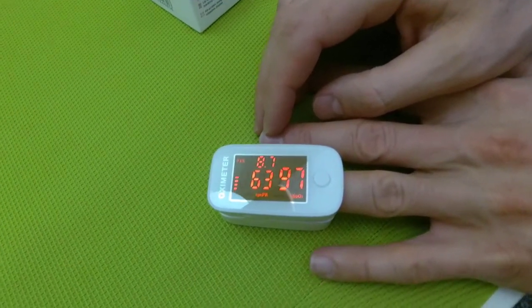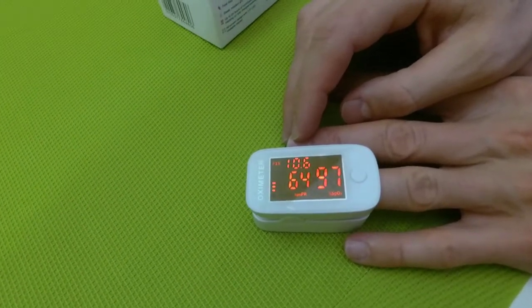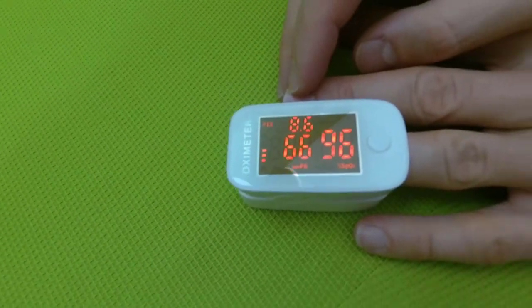It's a very important device because you can control the parameters of your body and know if you have any troubles with your health.